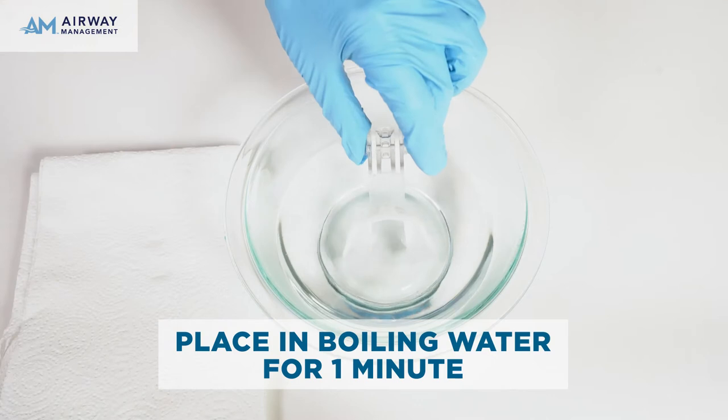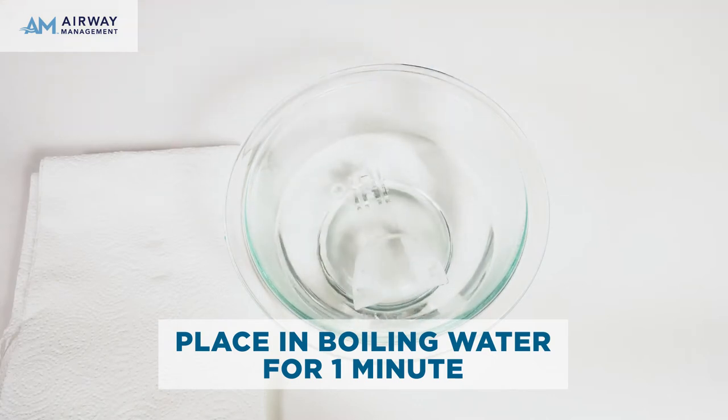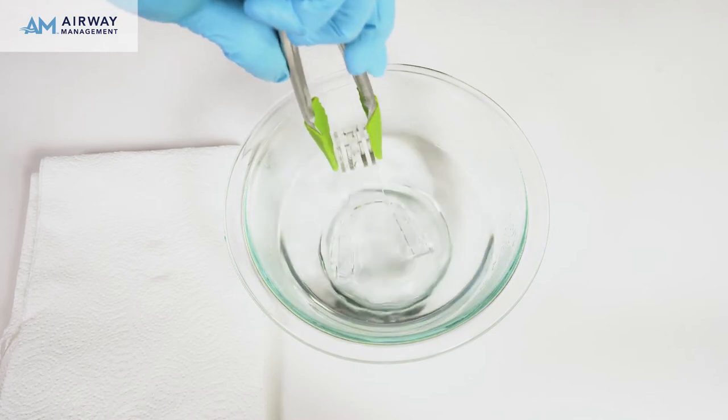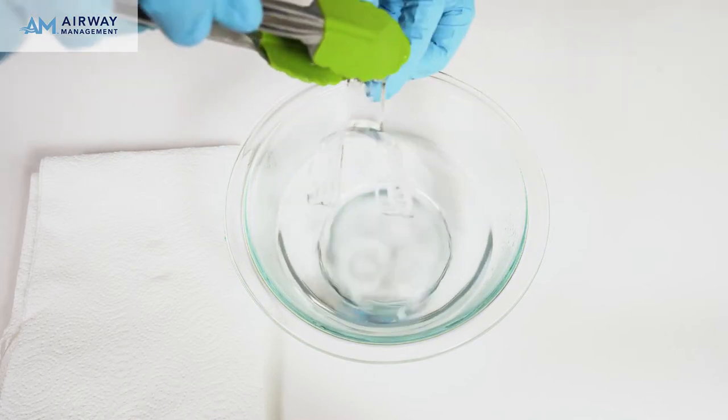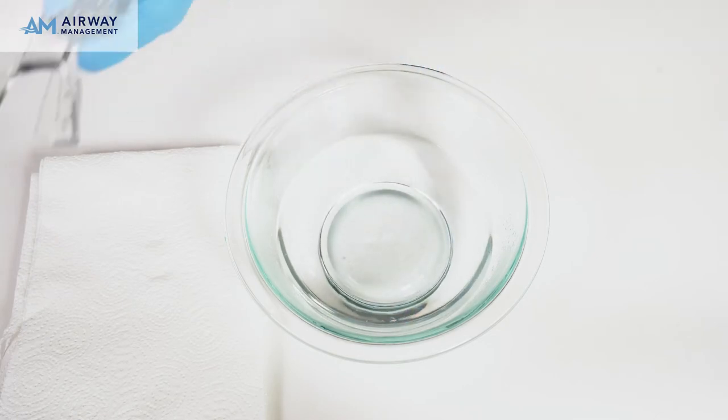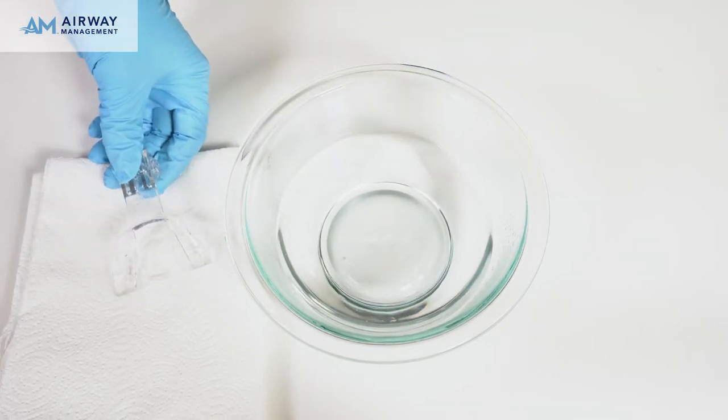Submerge the entire mouthpiece in boiling water for 60 seconds. Using a set of tongs or a fork, carefully remove the mouthpiece from the boiling water and vigorously shake off the excess water. Then let the mouthpiece sit for 20 seconds.